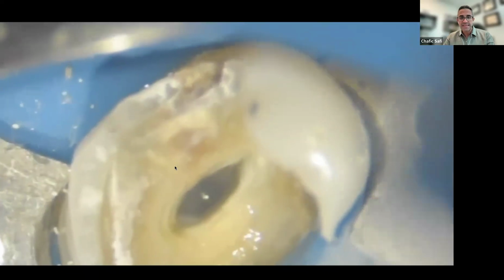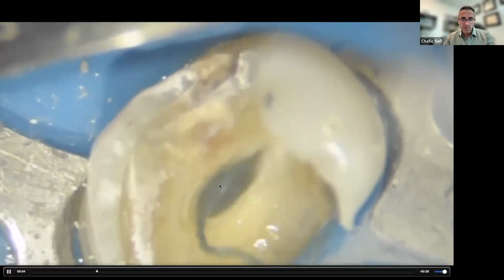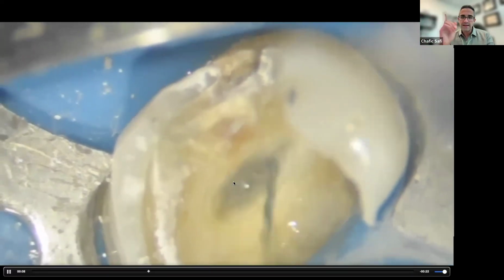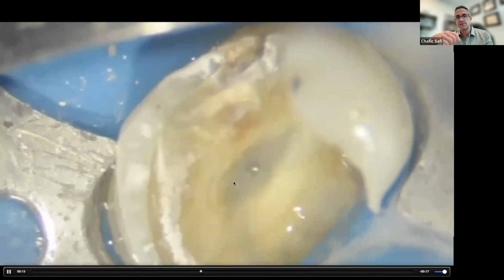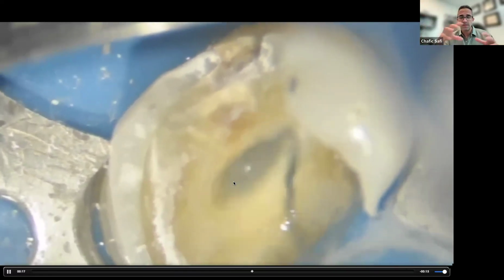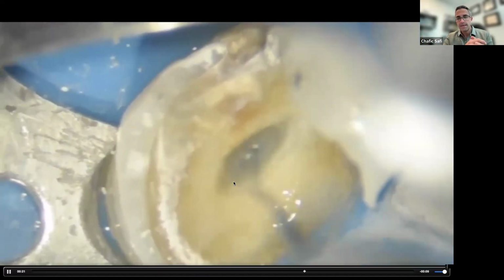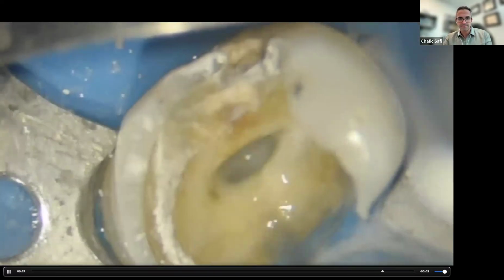As you can see, this is the action of the file inside the tooth. In an oval canal, you can clearly see and appreciate how it's going to really go back and forth in a buccolingual direction, and it's going to agitate this fluid inside the tooth. That's going to really send this fluid in the dentinal tubules in order to really favor better cleaning and disinfection against the bacteria that travel down the dentinal tubules.